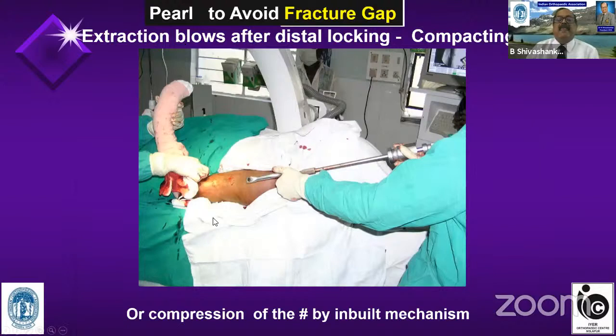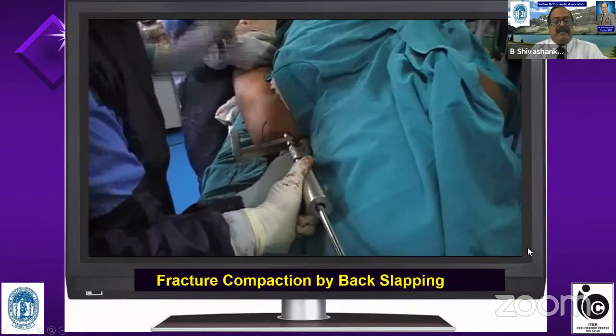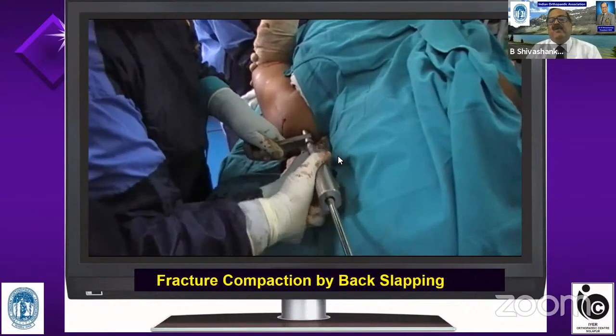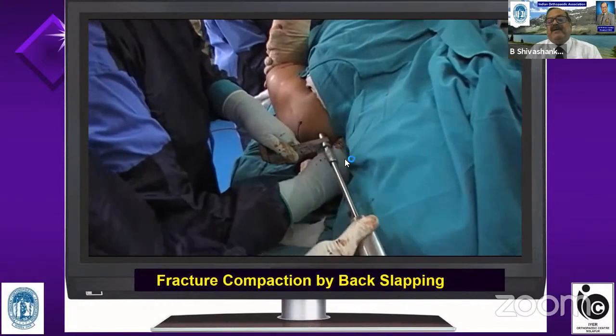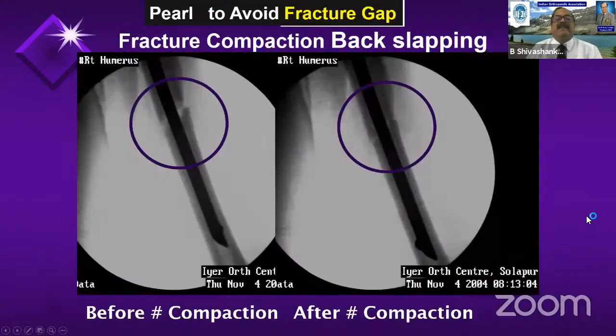And I almost always do the anteroposterior locking, so I don't find any problem with the C-arm in the same position. After having done the distal locking, always extract the nail to compact the fracture site. This is how I normally extract the nail to compact the fracture site. I have already done the distal locking. You can see one hand is pressing the shoulder, giving counter support, and extraction is being carried out. That will compact the fracture.